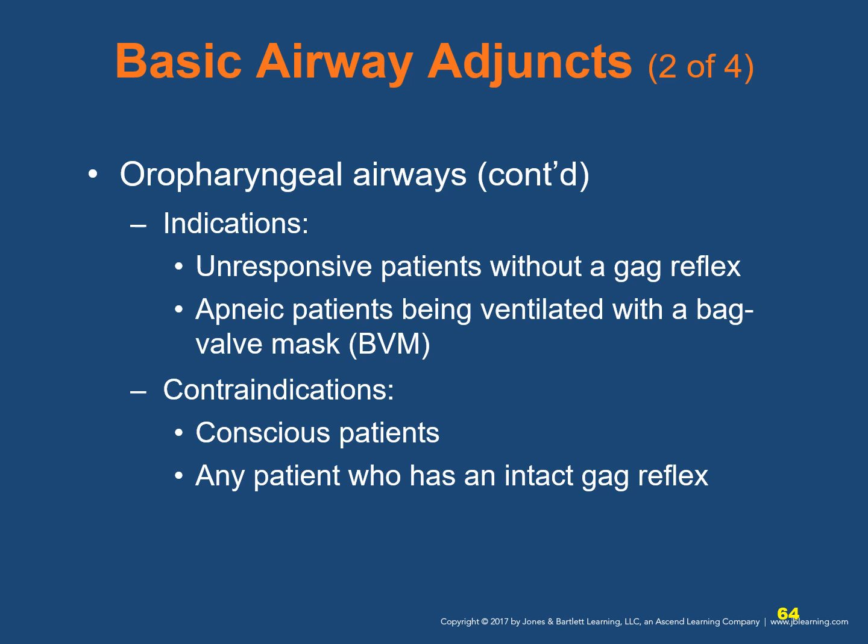An oral airway that's too large could push the tongue back into the pharynx, blocking the airway, so make sure to measure it correctly. An oral airway that's too small could block the airway directly, like a regular foreign body obstruction. So to practice this and be able to insert them properly and measure them properly, you will practice this in skill drill 10-4. If you encounter difficulty inserting the oral airway, there is an alternative method that may be used, inserting with a 90-degree rotation, and you'll see that in skill drill 10-5.